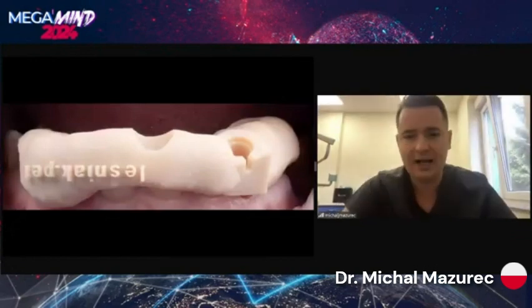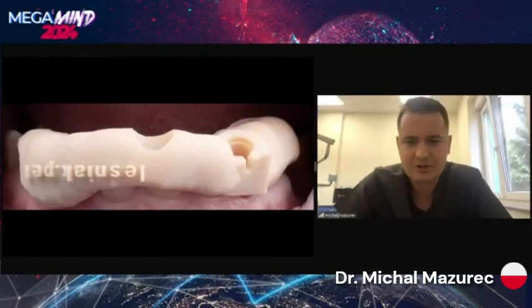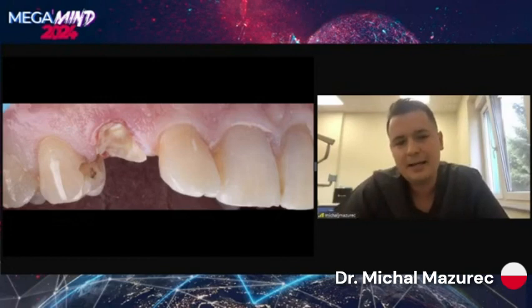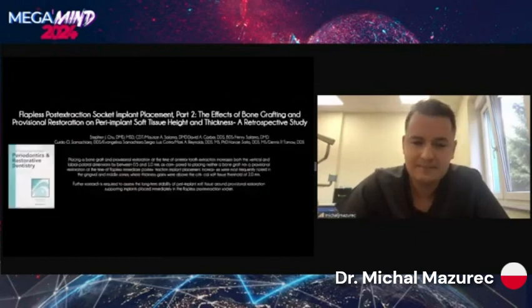So here we place our first guide, which is connected to the partial extraction technique. We drill through the guide. I always drill up to a 3.3 millimeter drill, so that I'm sure that I remove the apex and I make my PET thinner. I want to make it around 1.5 to 2 millimeters.